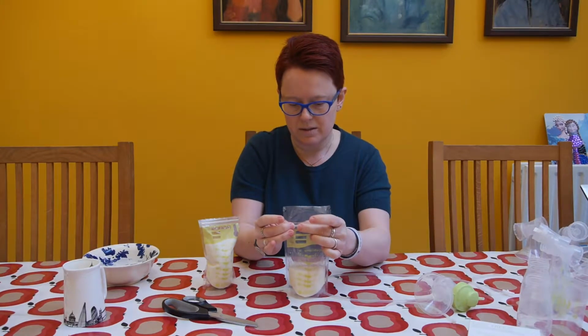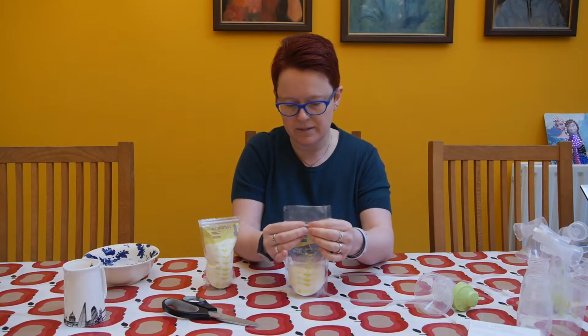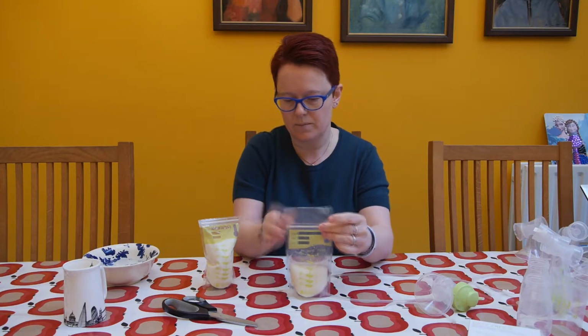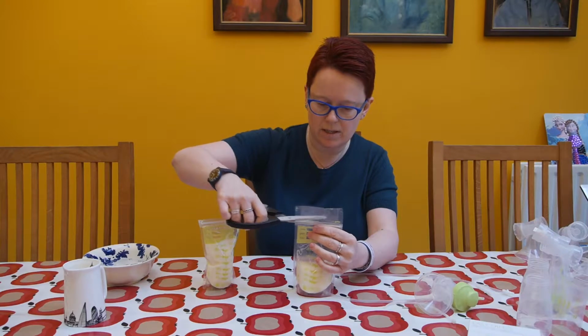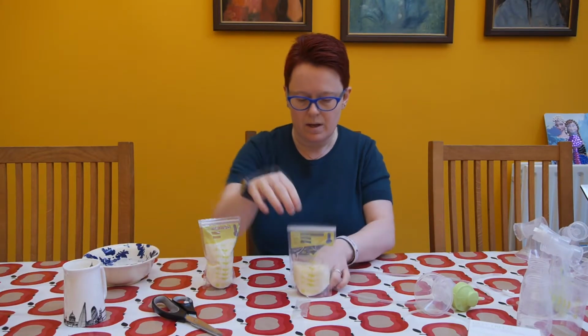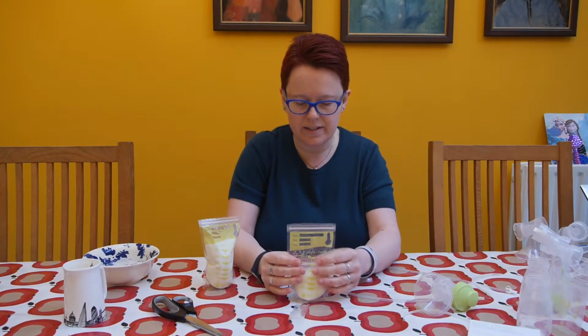I'm going to seal my bag, take out the excess air because milk will expand in the freezer, and seal my bag nice and tightly with the Ziploc feature. And now I'm going to cut that extra top bit off because we don't need that anymore, where it has a number 2. And that would now be ready to store in the fridge or in the freezer.